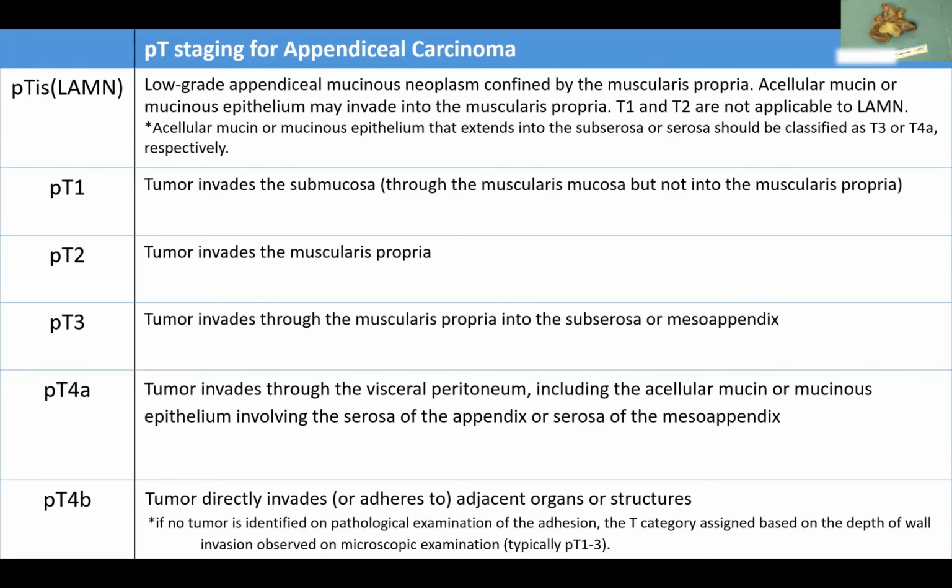And that's why it's a bit painstaking to examine these things histologically, because not only are you looking at a lot of samples, but for the most part, you're looking at very empty material, and you're really hunting for those 1 or 2 atypical looking epithelial cells, which can be difficult. It can be aided by immunohistochemistry if you need to.